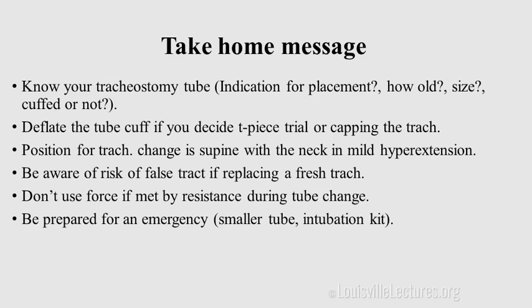Be prepared when you are changing a trach. It may be straightforward, especially if it has been there for a long time, but you have to be careful — it's an airway. You have to have an intubation kit available, a bougie, and a small endotracheal tube. In a stoma emergency, you can place a bougie without resistance and slide a size-6 endotracheal tube over it into the stoma, then confirm position with a CO2 monitor and get help.